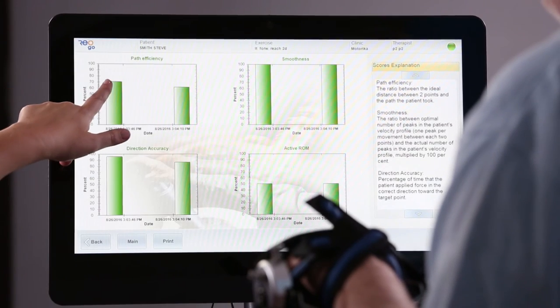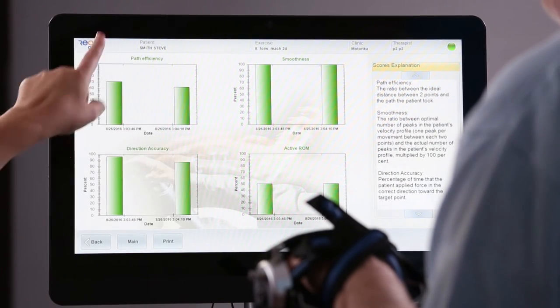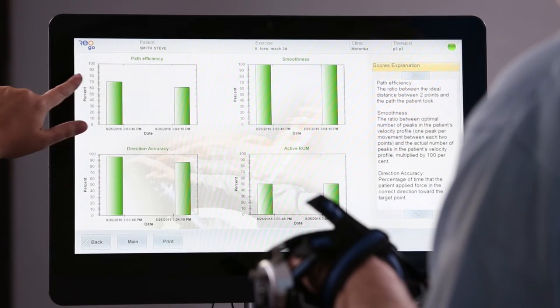Another great advantage to using the REOGO is that it will provide quantitative data on a patient's progress, which can then be used for insurance purposes or as great feedback to motivate patients.